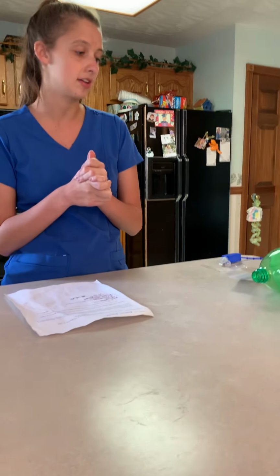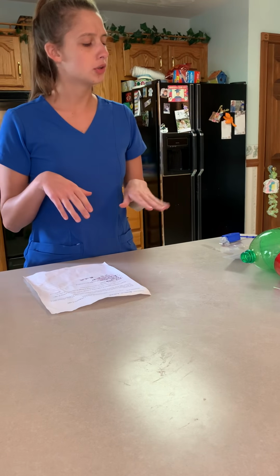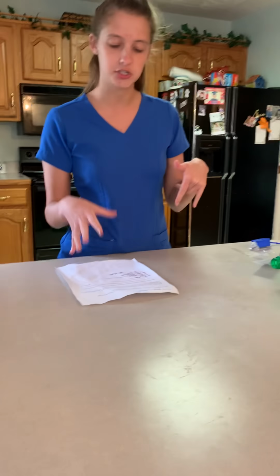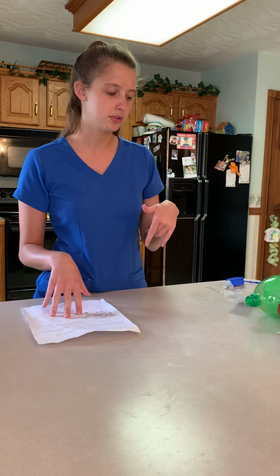Next, I'm going to explain the procedure to the patient. Today we're going to be inserting a retention catheter to a dependent drainage. Is that okay with you? He says yes. Okay. Can you tell me where you are? He says the College of Nursing building. Can you tell me what day it is? He says Wednesday. Can you tell me what month is coming up next? He says May. So the patient is alert and oriented times 3. Are you allergic to betadine or latex? The patient says no, so therefore it's okay to continue on with the procedure.